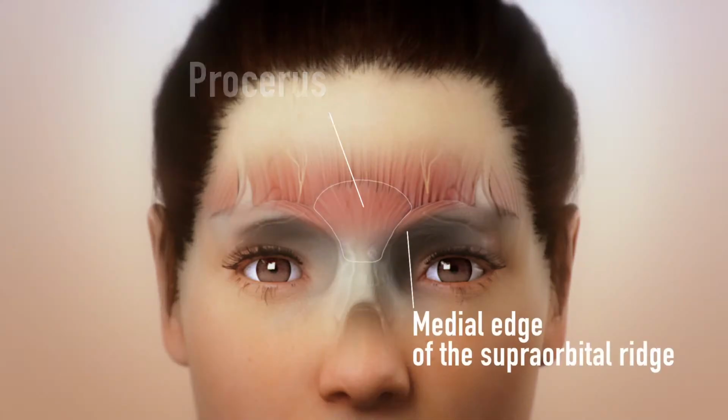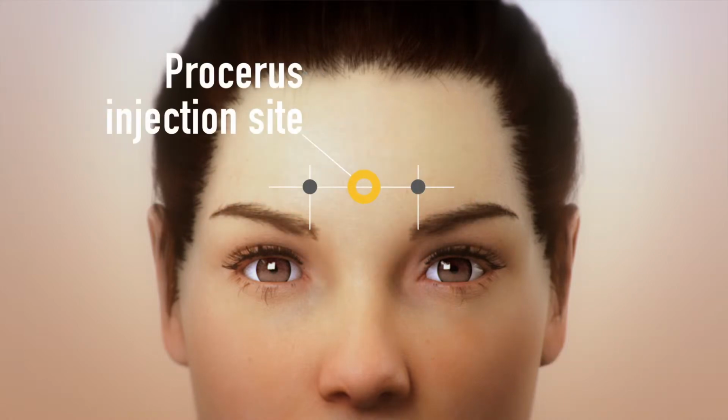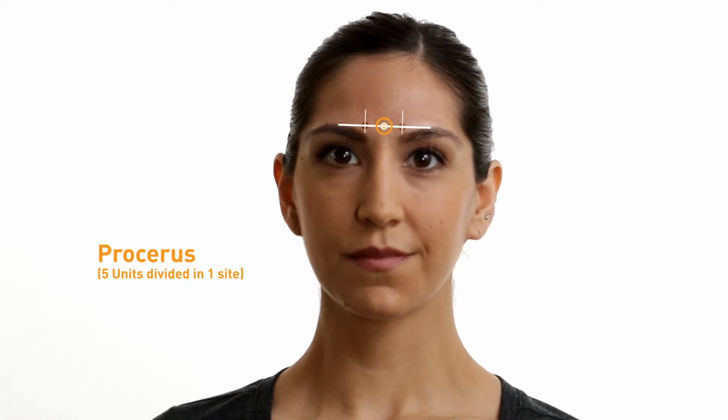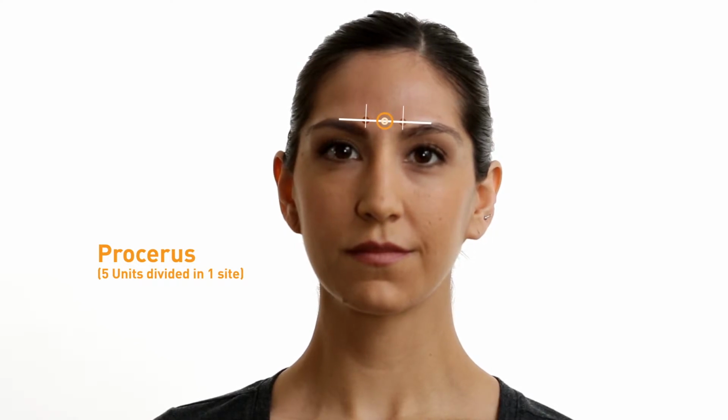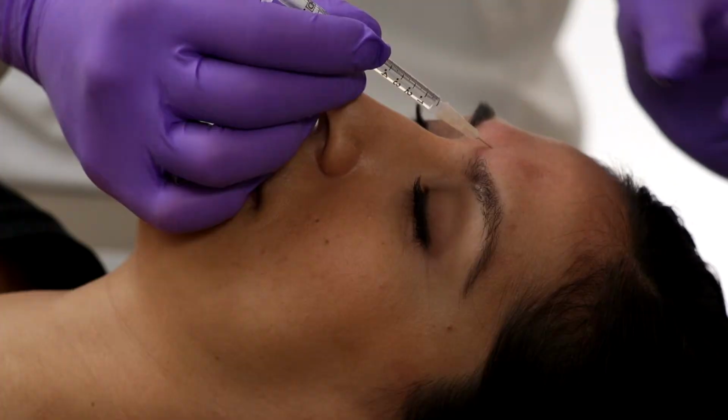The procerus muscle is located midline on the forehead, approximately 1.5 centimeters superior to the supraorbital ridge between the eyes. The injection site for the procerus should be approximately midway between the two corrugator injections. It may be helpful to visualize a single straight horizontal line connecting all three of these injections.